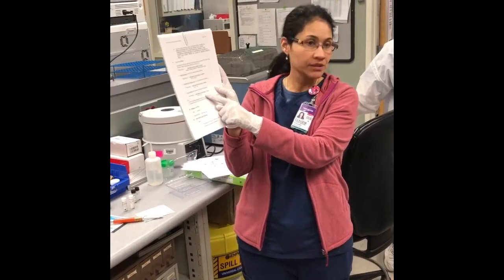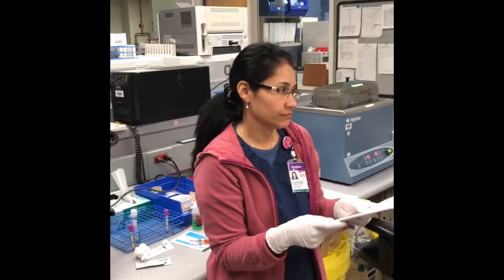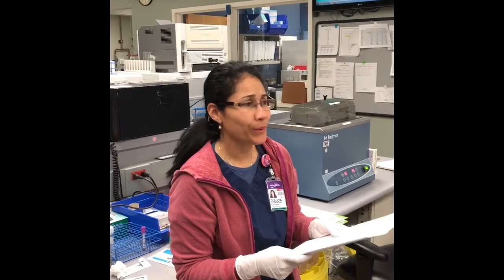Okay. And then I should do this. You count everything for the survey? Yes. Nine squares on each side. Yeah, so that we don't overcount.